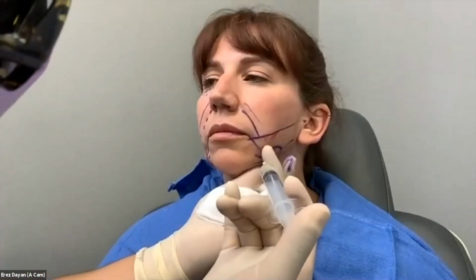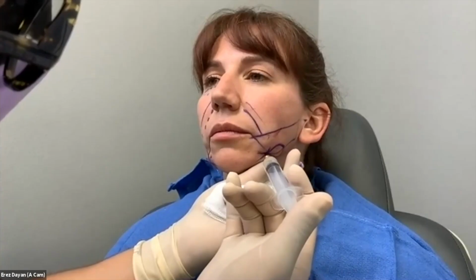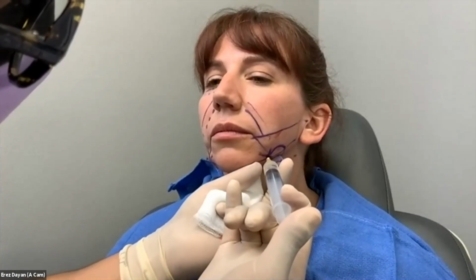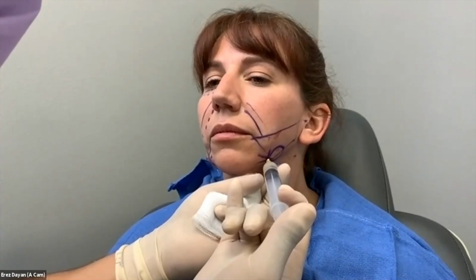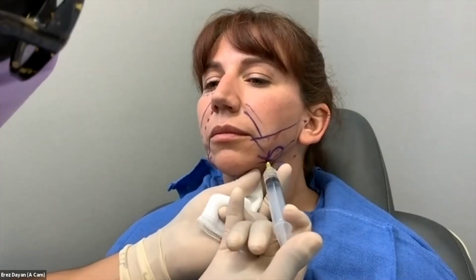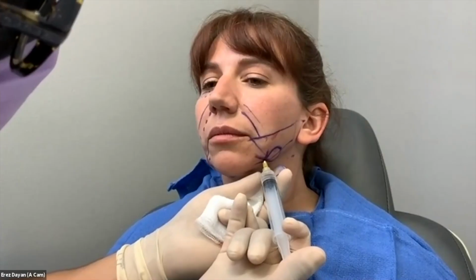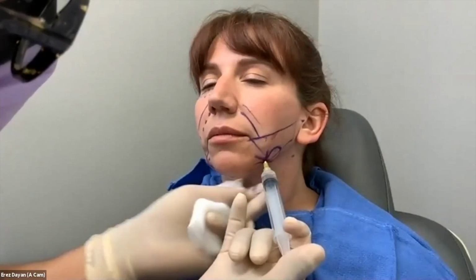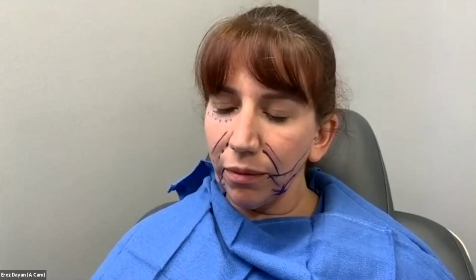They will be swollen from the tumescent, so that you have to tell them. So you'll be a little swollen from this here, Sandra, from the tumescent. Mm-hmm. You okay? You feeling that a little bit? Mm-hmm. And once you have the local technique down, everything else is pretty easy. So this is just the 1% Lido with epi. And we're just going to inject some tumescent.